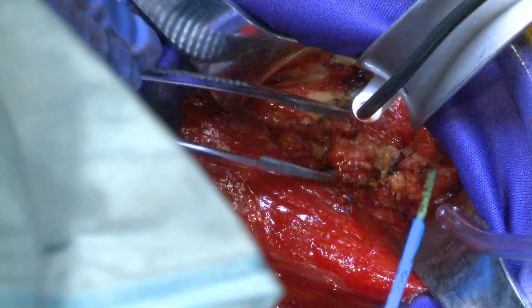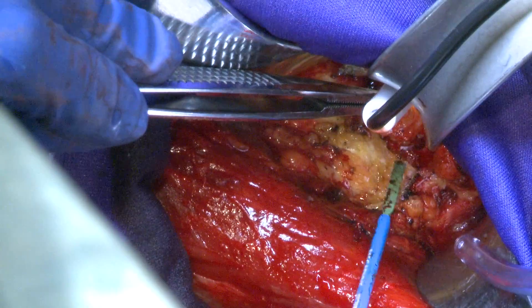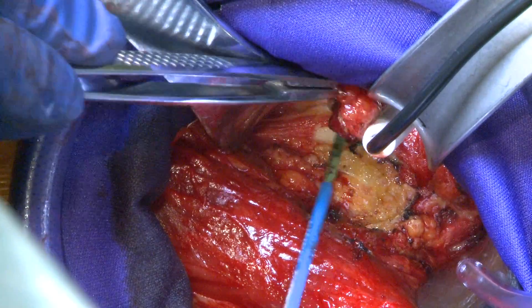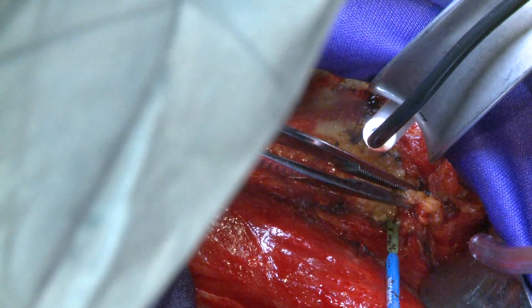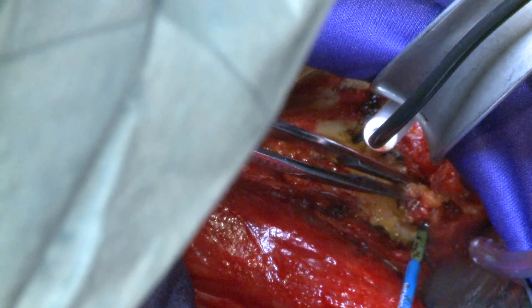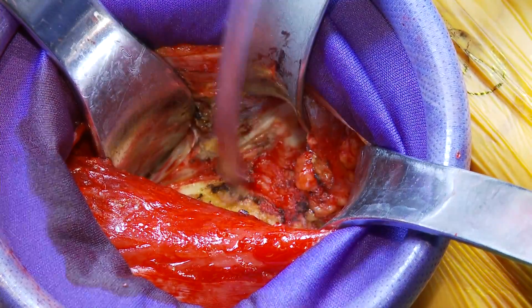I'm going to excise some of this capsular fat to give us better visualization, and then we're going to open up the capsule. The idea is to open the capsule right along the femoral neck to give us the best visualization.